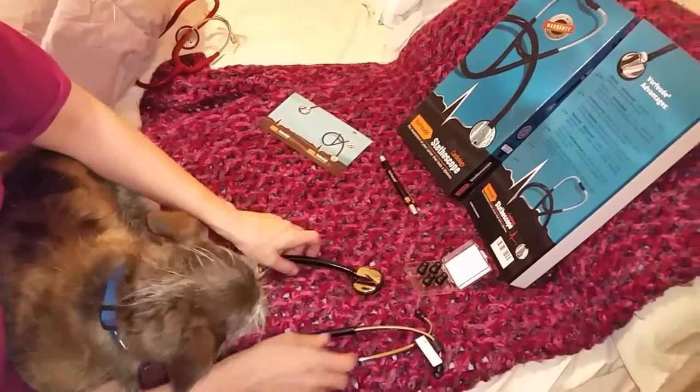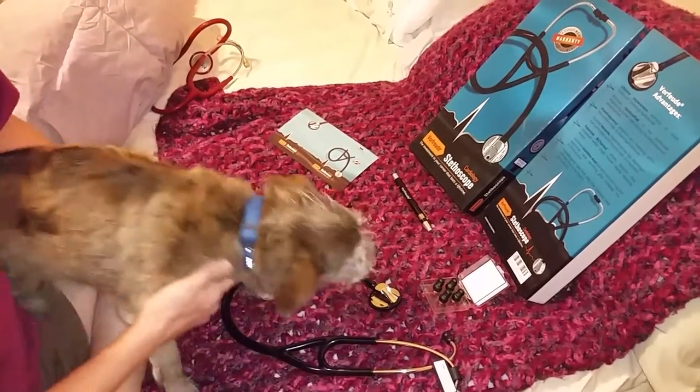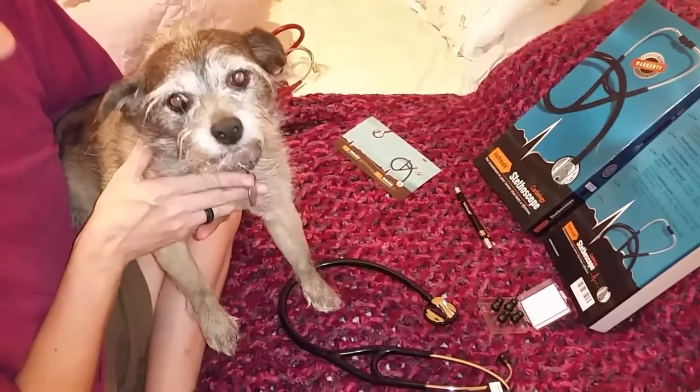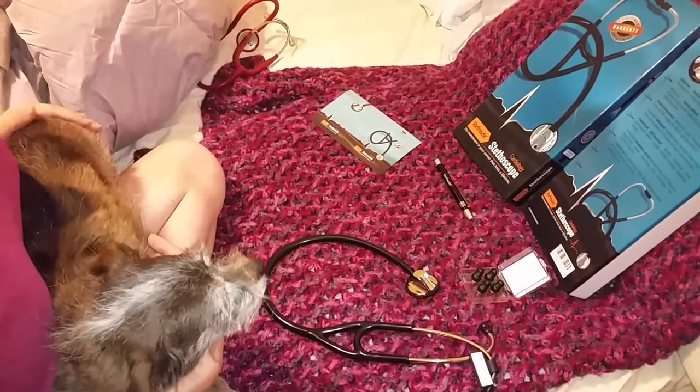Hi everybody! Here to show you the Vorfreude cardiology stethoscope. And of course Gizmo here is along to show you, as the dogs are always in the videos. So this is a cardiology stethoscope.